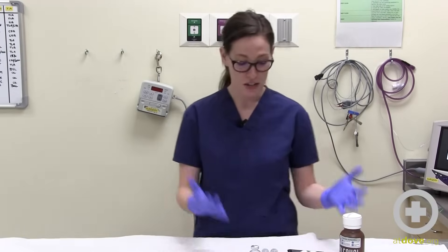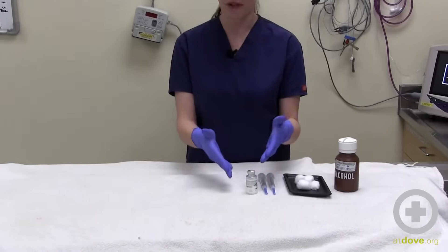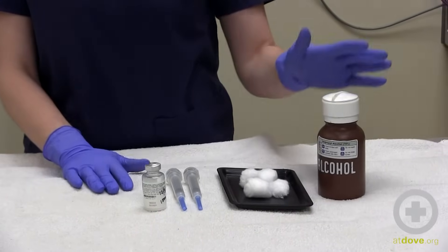Hi, I'm Jessica and I'm going to talk to you about the very basics of drawing up injectable medications with a syringe. So these are the supplies that you're going to need: the medication that you're going to be drawing up, a brand new syringe, cotton balls, rubbing alcohol at 70%, and gloves.